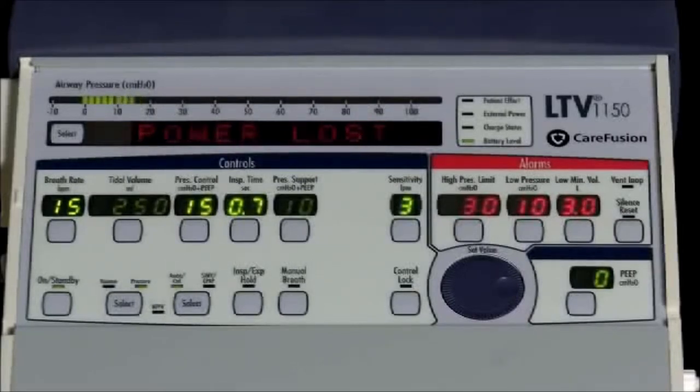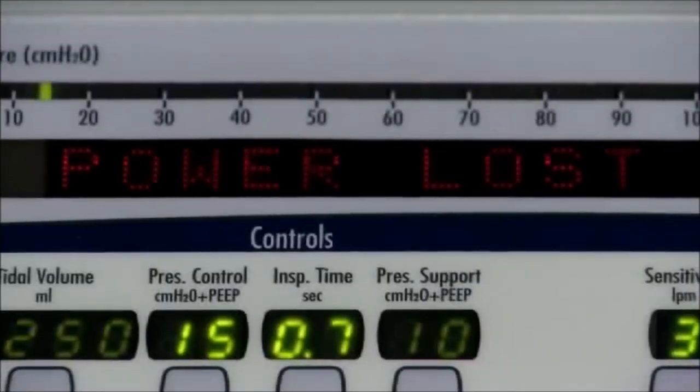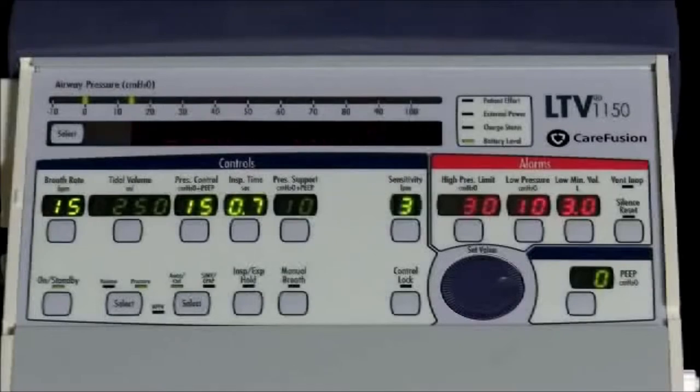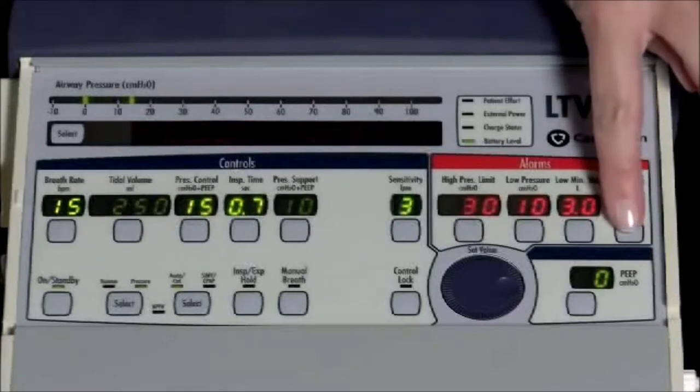The power lost alarm occurs when the ventilator is operating on external power and switches to the internal battery. The change to internal battery is made when the external power voltage drops below the usable level. There is no interruption in ventilation. When a power lost alarm occurs, the power lost message is flashed in the display window, the external power and charge status LEDs are turned off, and the battery level LED is lit showing the internal battery charge level. The ventilator begins operating from the internal battery and the audible alarm is sounded. After 60 seconds, the displays are turned off to conserve battery power. To reset the power lost alarm, press the silence/reset button twice.